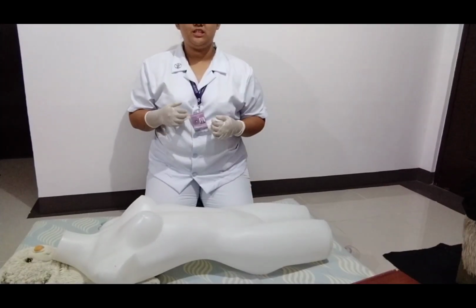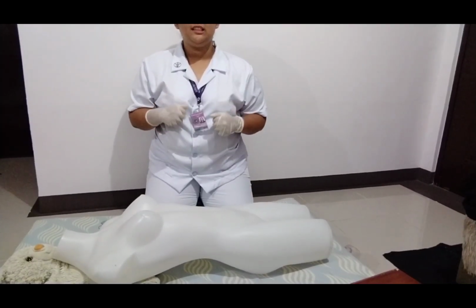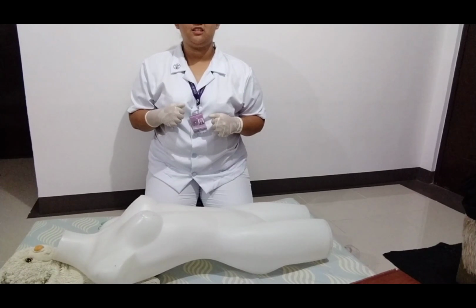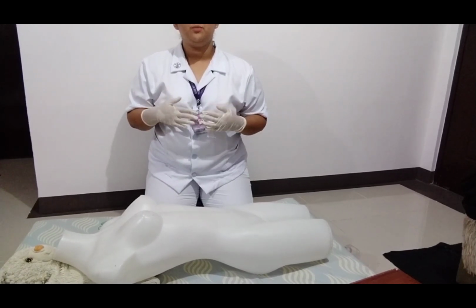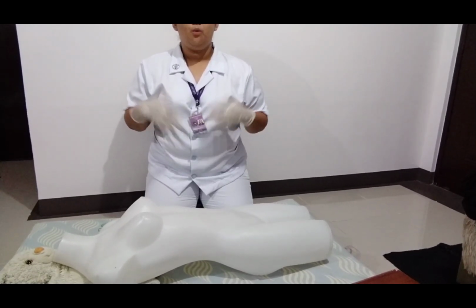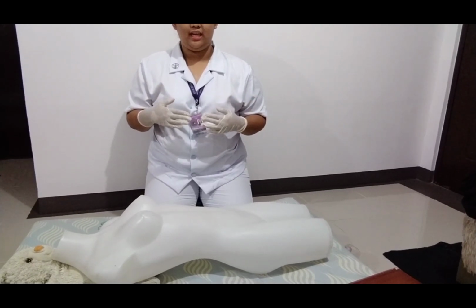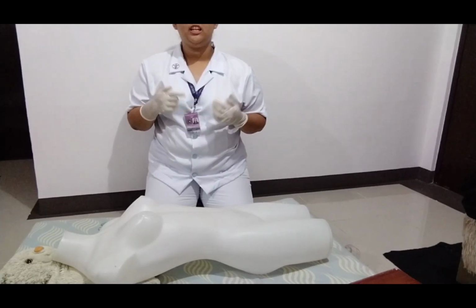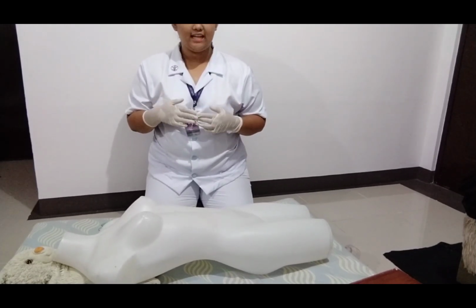Now, I am going to proceed with the AED skills. So, until the AED arrives, we'll have to continue doing the chest compressions and the rescue breaths until the AED is ready to analyze. So, assuming that I am the second responder, what I'm going to do is to turn on the AED. After turning it on, I am going to quickly scan the patient's chest.